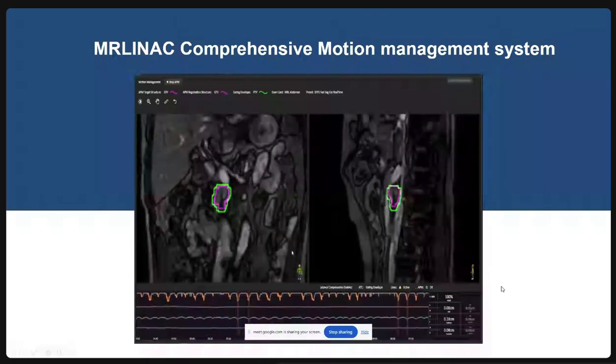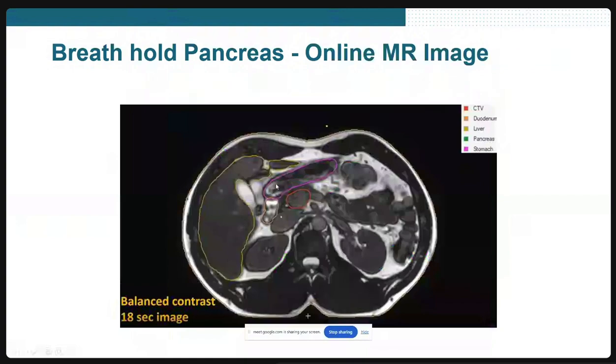This is our own patient whom we treated like this in our delivery. This is the quality of the image where you could really see the boundary. You can see that very close to structures you have the tumor. So we have to deliver a very high dose here, and at the same time reduce the dose to that. When you create such high gradients, you have to be very precise when you deliver the dose, and we have to be very careful when we do that.